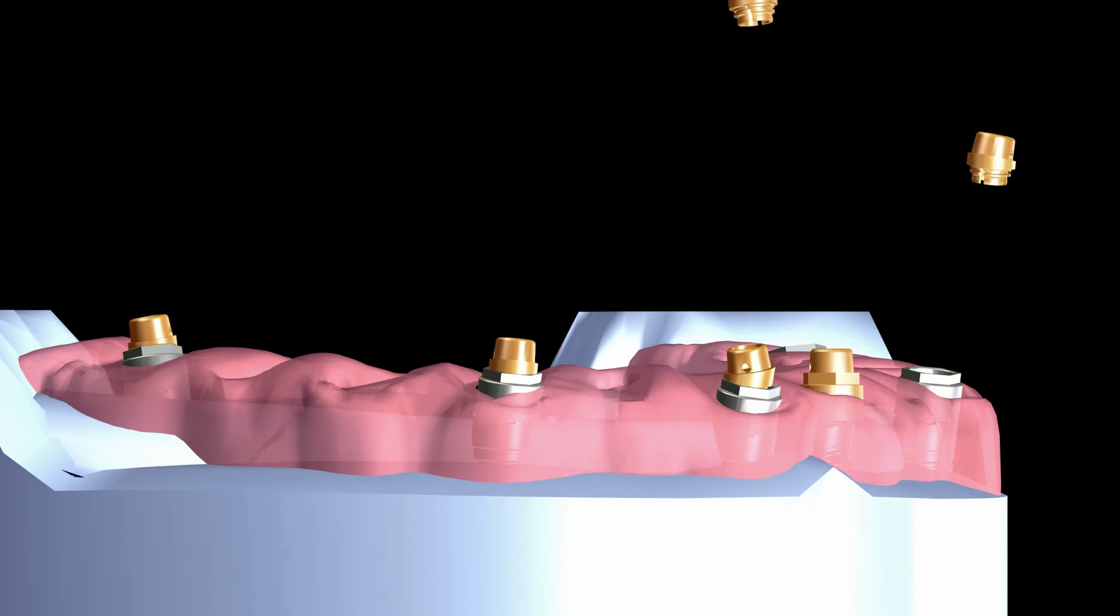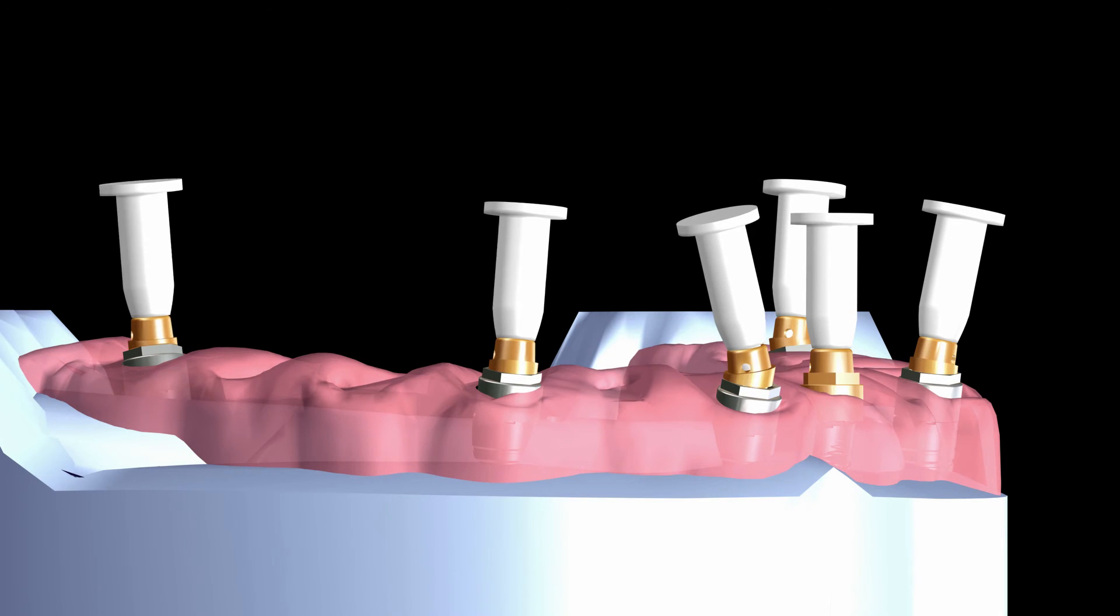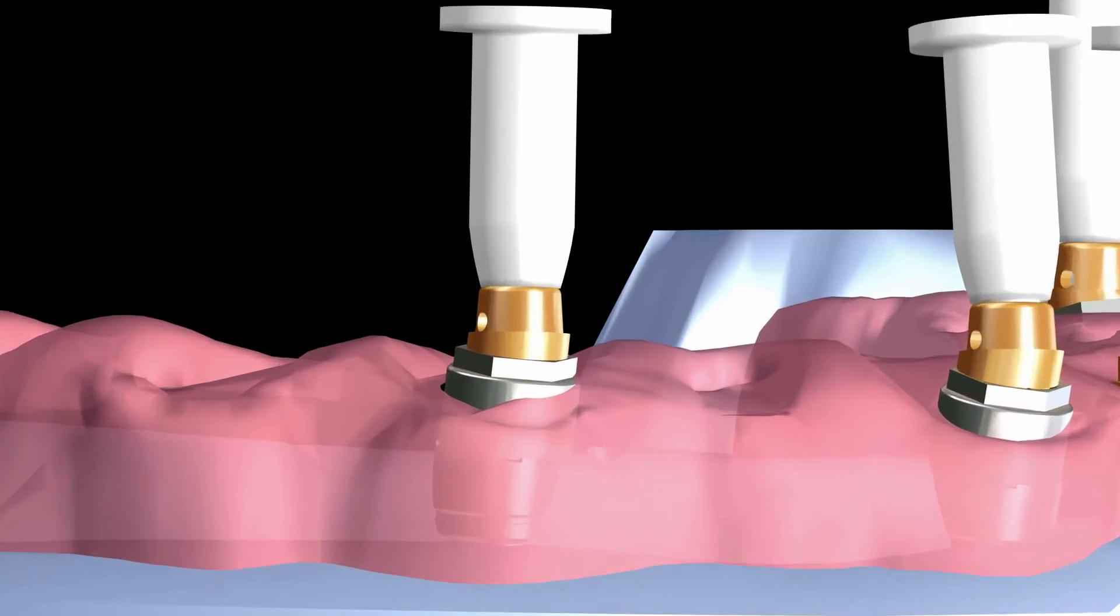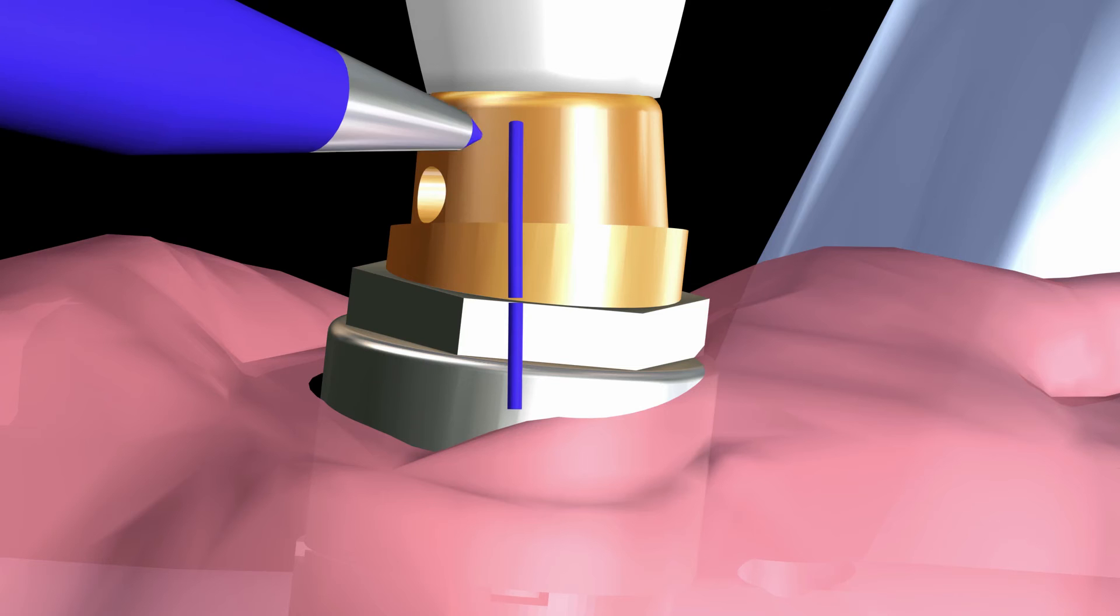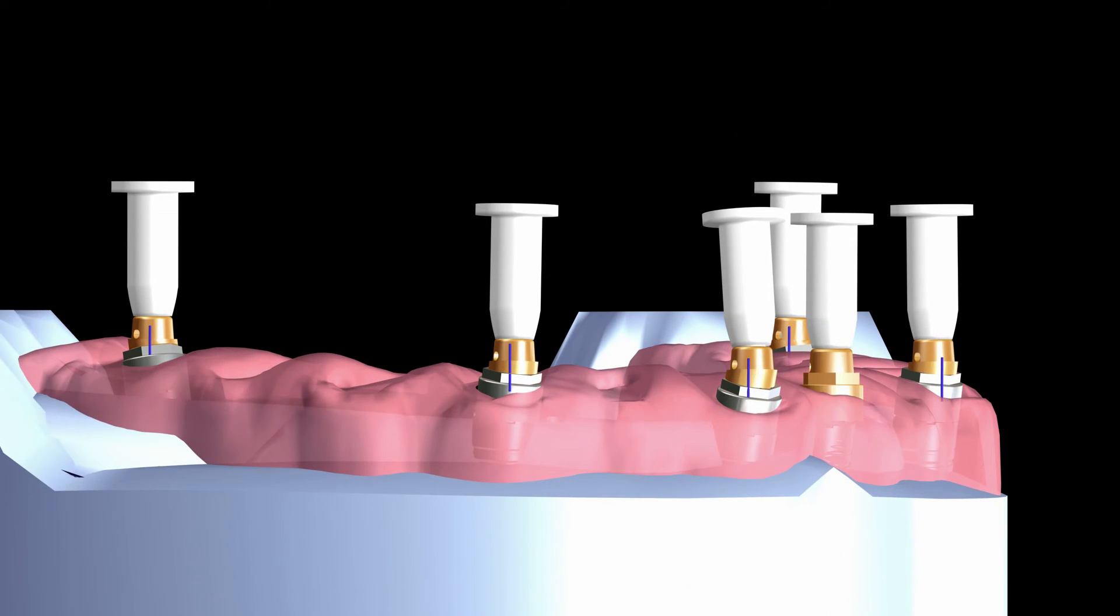The appropriate female is snapped into each base using a plastic alignment handle. The females are rotated until they line up with a zero-degree abutment. An indelible pen is used to mark a line across the junction between each female and base for cementing accuracy.